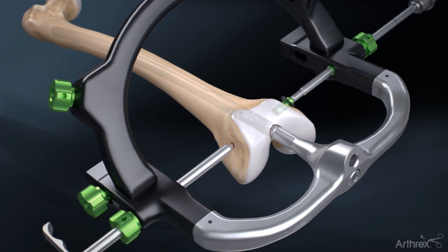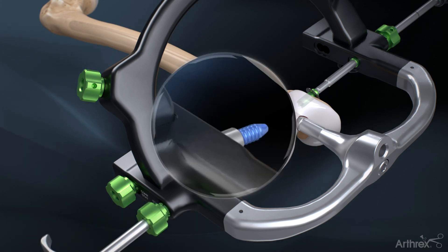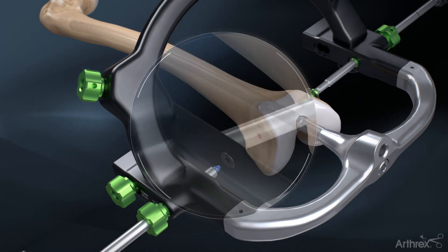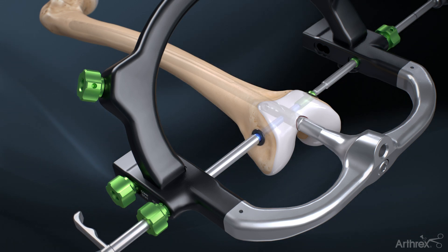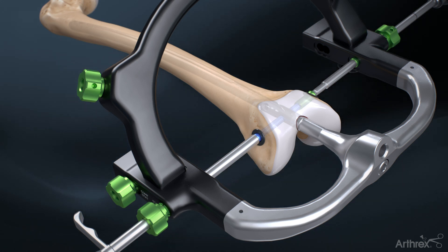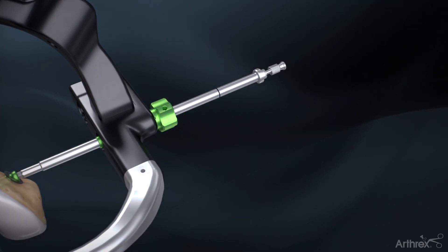Remove the obturator, drill bicortically with a 5.5 mm drill and remove the drill guide sleeve. Insert the 6.5 mm cancellous or cortical screw through the distal lateral hole with a washer on the inside of the targeting guide. It is recommended to subtract 5 to 10 mm from screw length when using the condylar nut to achieve desired condylar compression. Remove the T-handle assembly, lateral hex driver and screw sleeve.